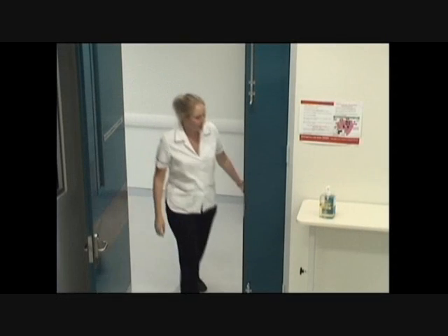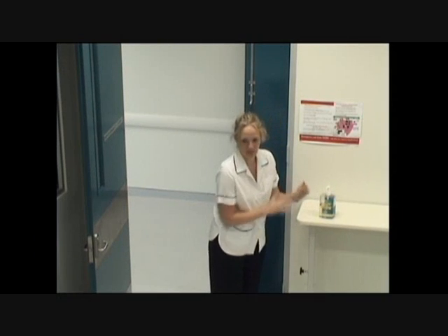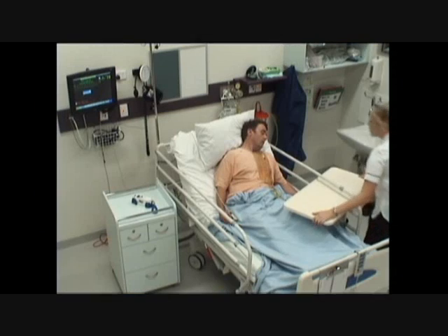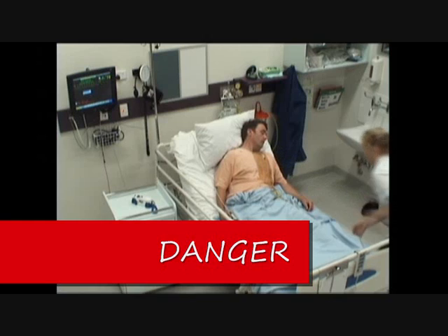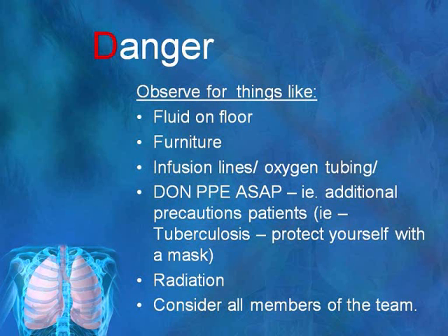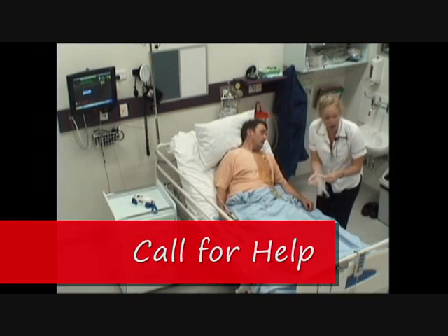Let's watch what happens as our nurse goes to introduce herself to our patient. The nurse can see that something is wrong, and as she approaches the patient, she is assessing for danger. Can you hear me? Can I have some help in here, please?